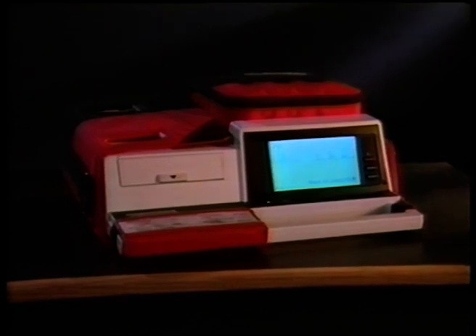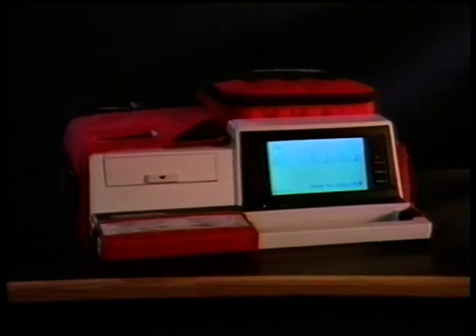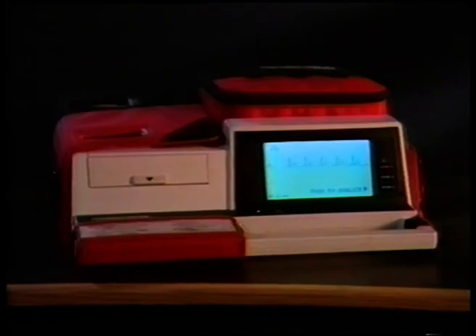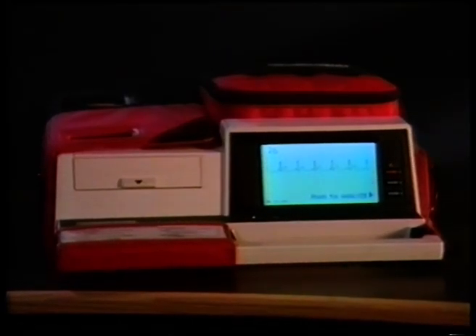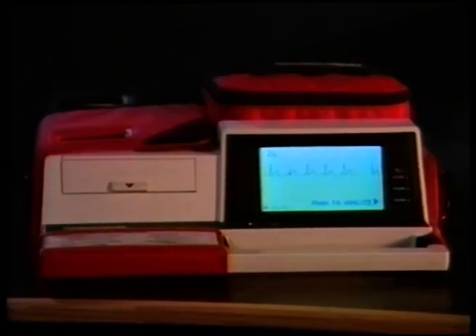The LIFEPAK 300 can be configured several different ways depending on the options chosen when it is purchased. For simplicity, we have chosen to show one configuration in this video, a LIFEPAK 300 with a strip chart recorder, ECG waveform display, and voice prompts. Your device may not have the same set of features shown in this program.